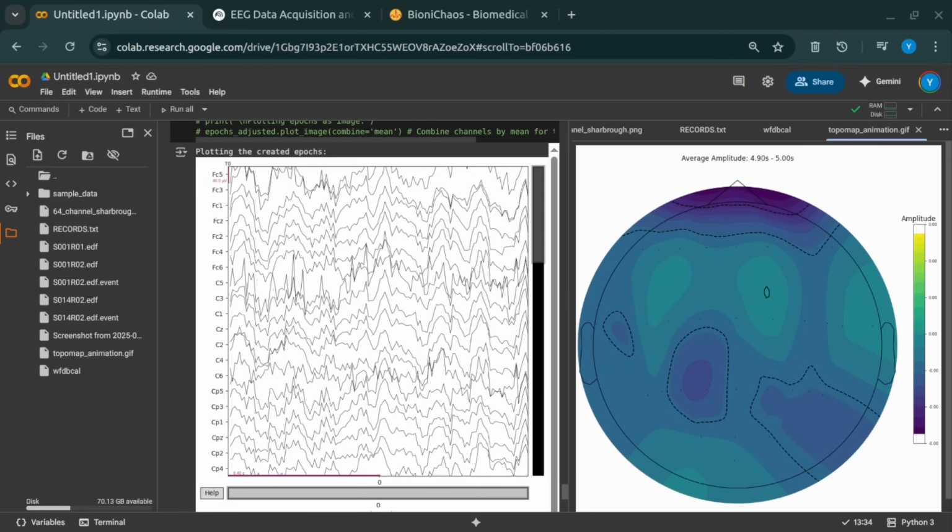Pretty much. When you first started digging into this specific data set, did you run into any immediate roadblocks? Like, what was the first sign you actually had a problem? Oh, absolutely. The very first hint that our puzzle pieces weren't quite fitting came as a value error. Python loves throwing those, doesn't it? And it loudly proclaimed, the following electrodes have overlapping positions. That message was our clear signal that, despite our careful planning, we still had some deep-seated mismatch issues to sort out with the channel locations, probably stemming from those initial naming discrepancies we talked about. Right. It was the moment we knew we needed to put on our serious detective hats.